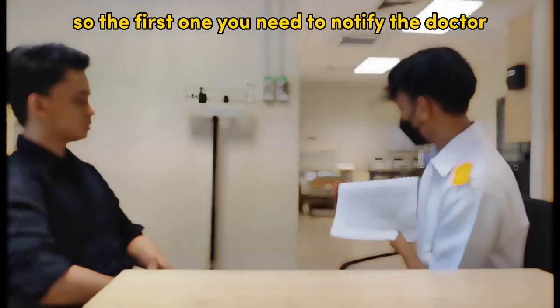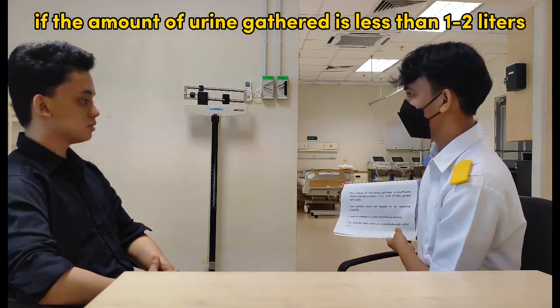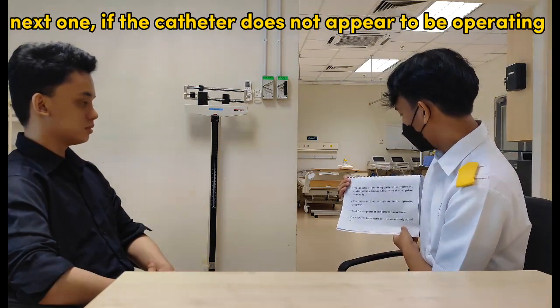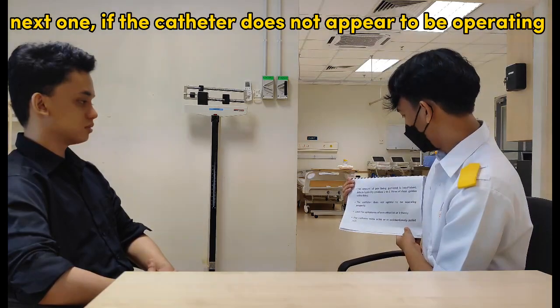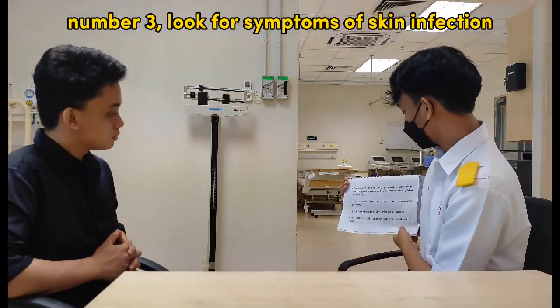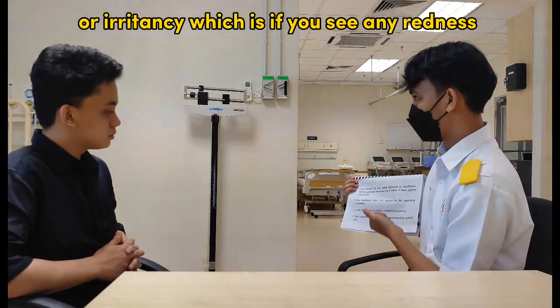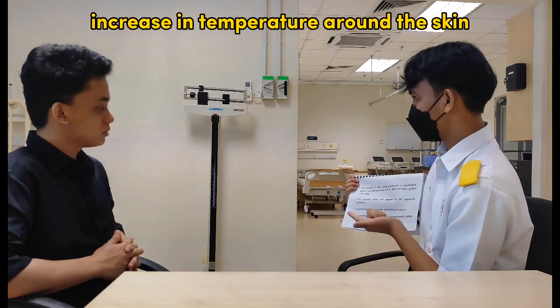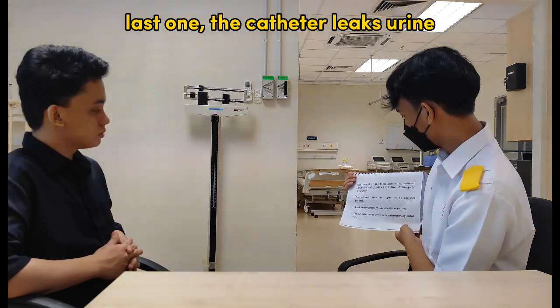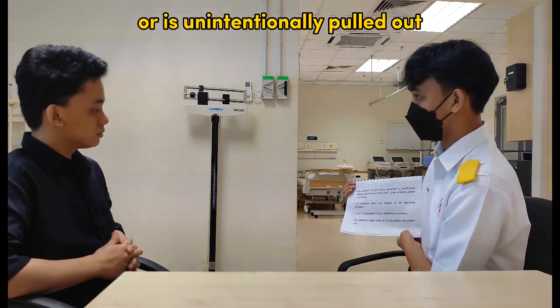So the first one, you need to notify the doctor if the amount of urine gathered is less than 1 to 2 liters. Next one, if the catheter does not appear to be operating properly. Number three, look for symptoms of skin infection or irritancy, which is if you see any redness or increase in temperature around the skin, so you need to notify the doctor. And the last one, the catheter leaks urine or is unintentionally pulled out.